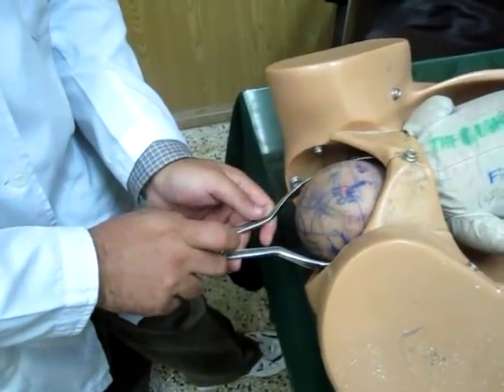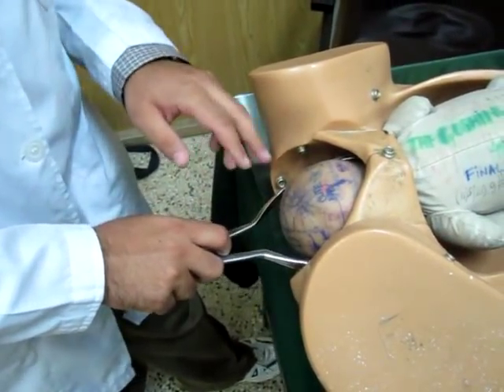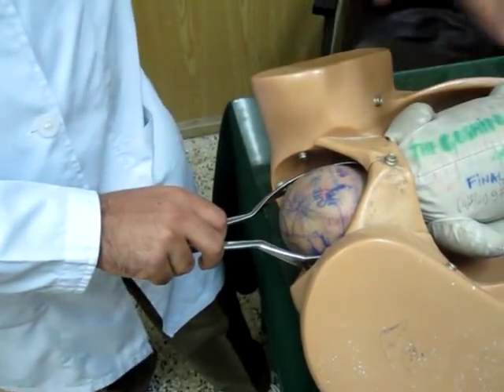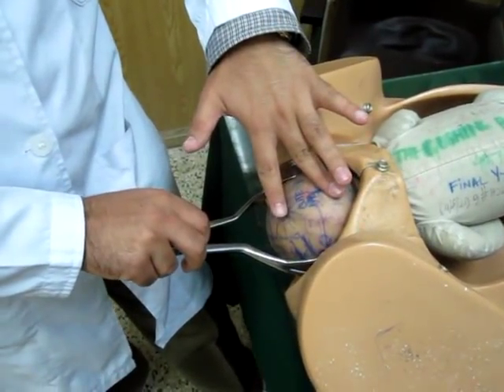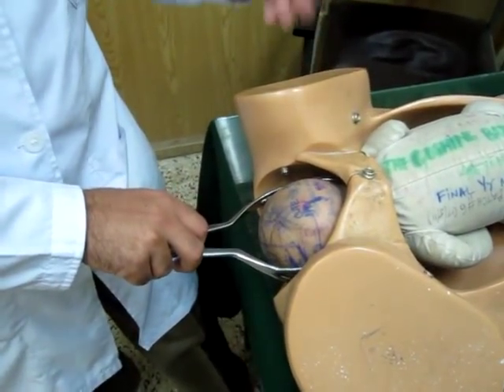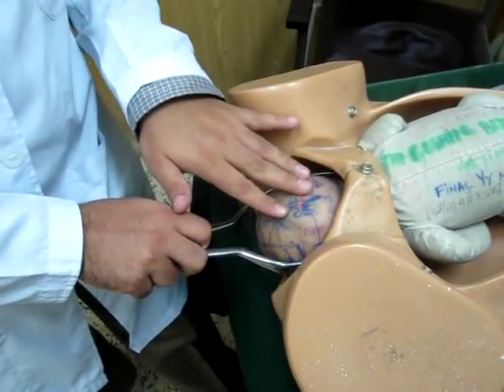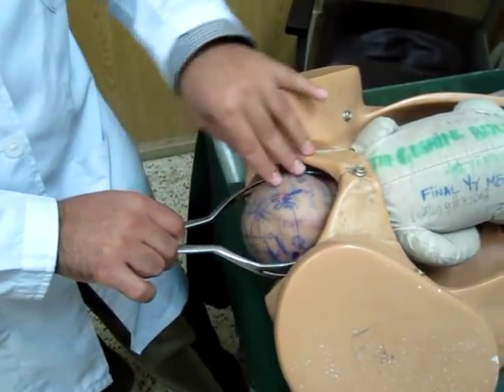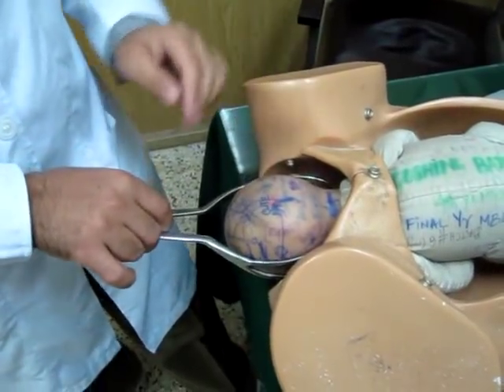Keep in mind that you must not apply so much pressure as to cause damage to the fetal head. When it is locked, all you have to do is wait for the maternal contraction. When the contraction comes, the baby's head descends and you apply traction along with it. Do not apply any traction if there is no maternal contraction — absence of maternal push is a contraindication. You just help with the delivery of the head with the maternal push.